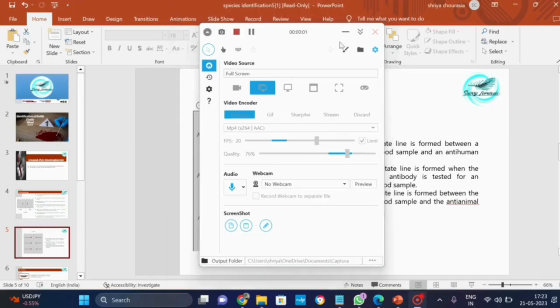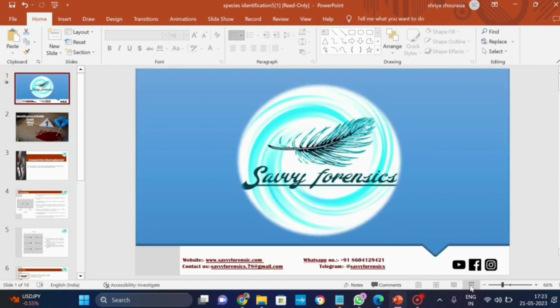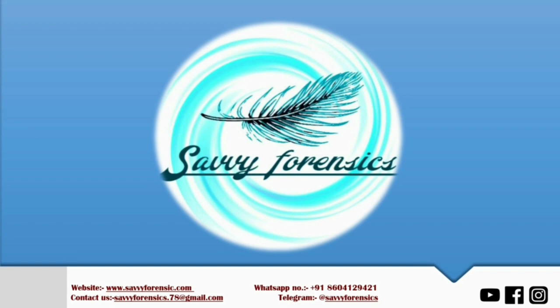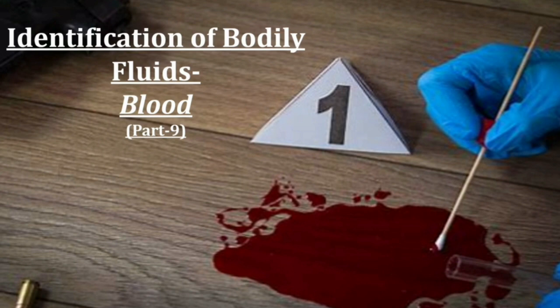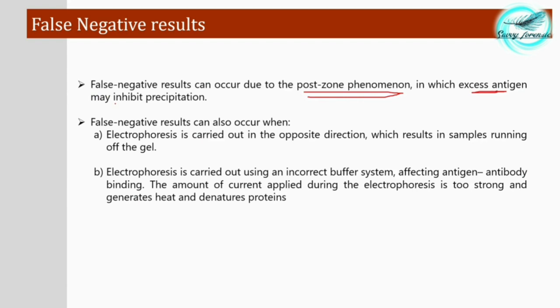There are certain cases where false negative results can occur. The first is the post-zone phenomenon, where an excess of antigen in the sample inhibits the precipitation process. This is one reason why you should not apply stained material directly — you should first extract it using distilled water or saline.